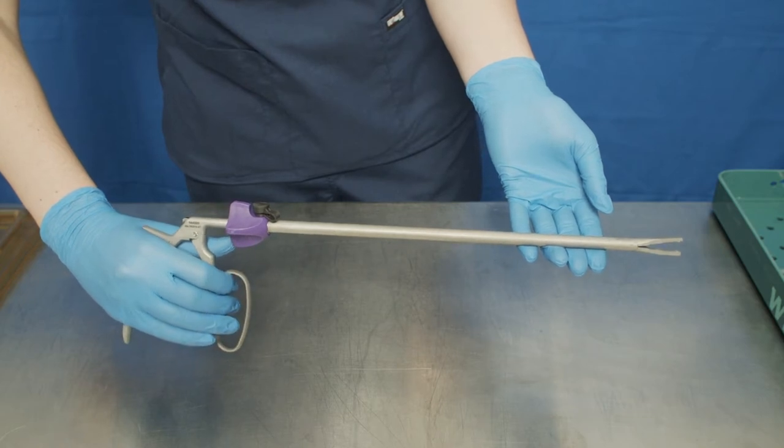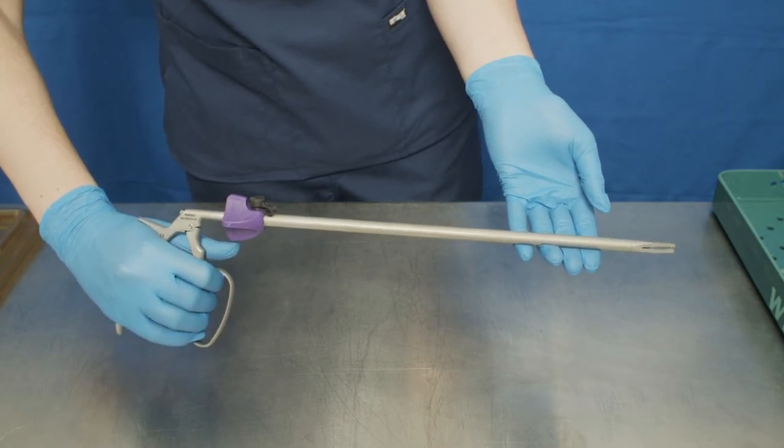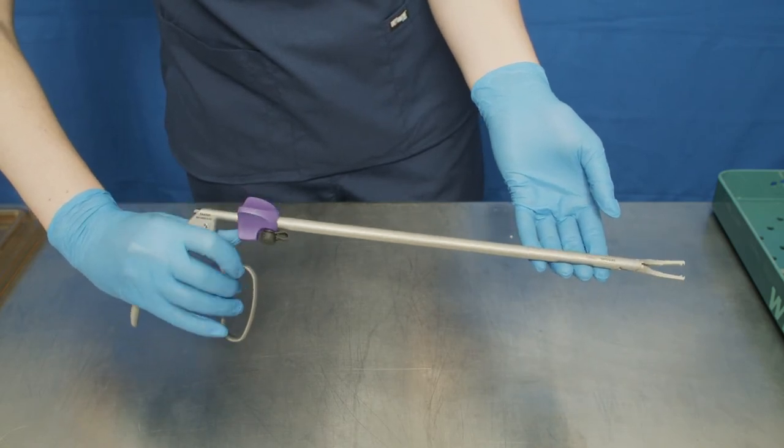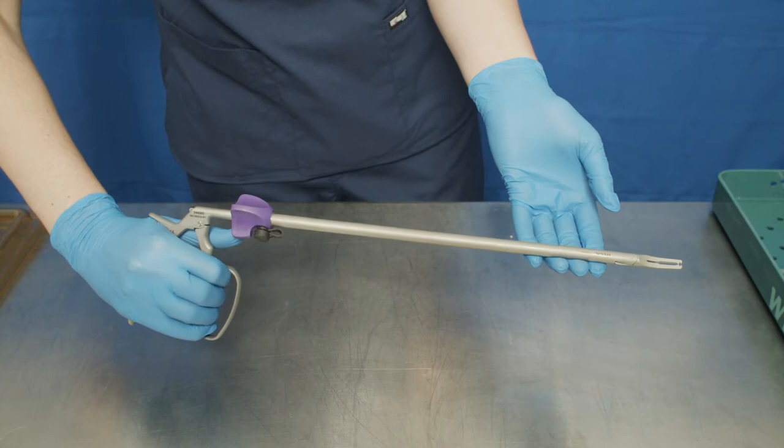First, take the applier and open and close the handle. Using your finger, rotate the applier knob. The applier knob should only be rotated with the jaws in the open position to avoid damaging the applier.